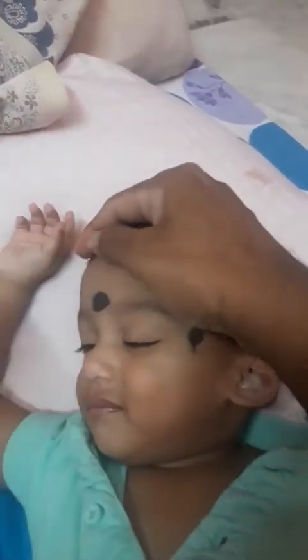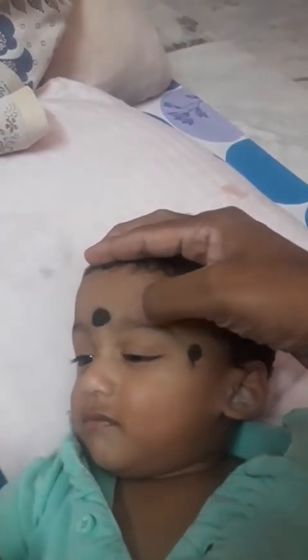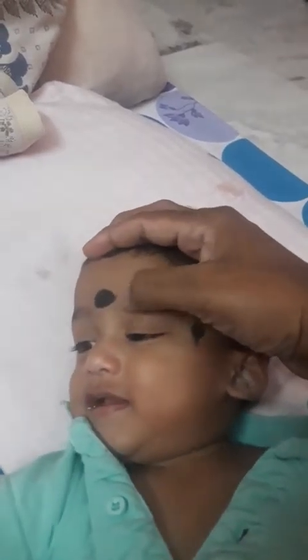The forehead is the planum. So, drill the planum and identify the optic nerves. In that way, you get an important landmark of the optic nerve.